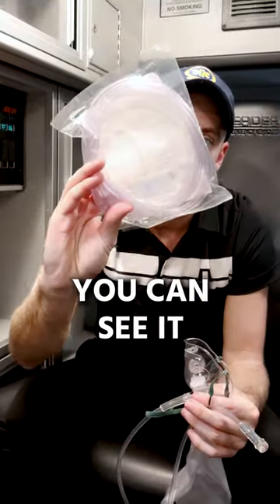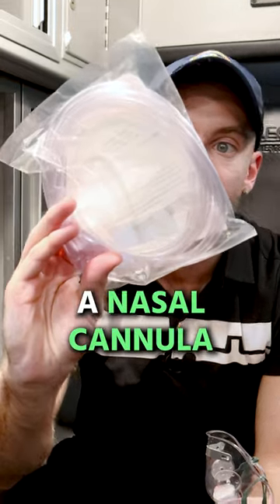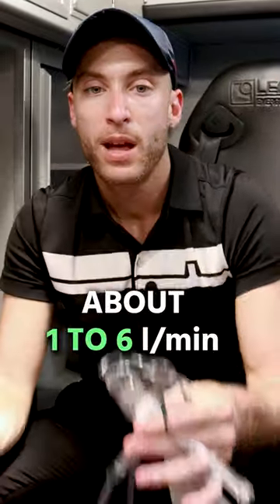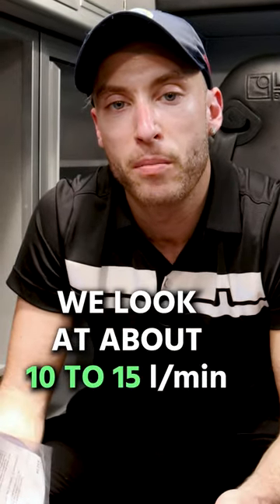In here — I don't know if you can see it — this is actually a nasal cannula. This is an adult nasal cannula. The nasal cannula goes through the nose at about one to six liters per minute. And for our non-rebreather, we're looking at about 10 to 15 liters per minute.